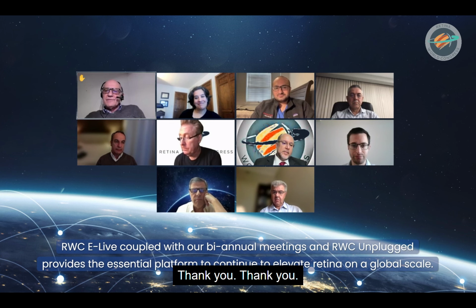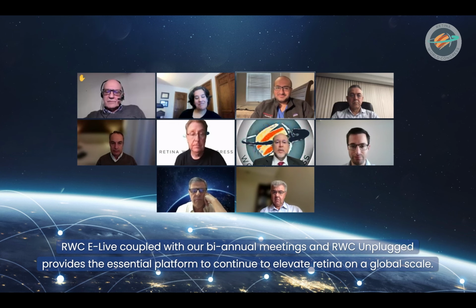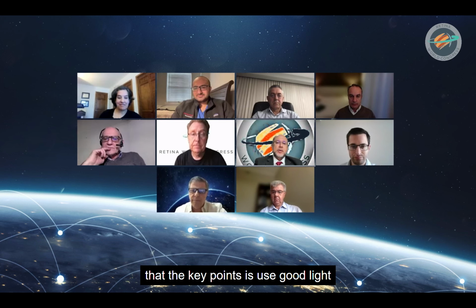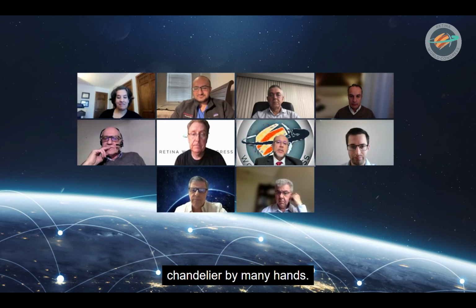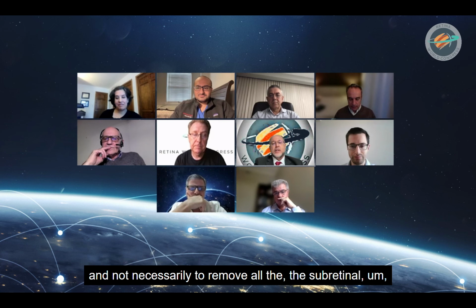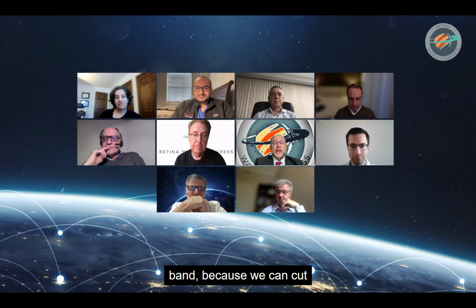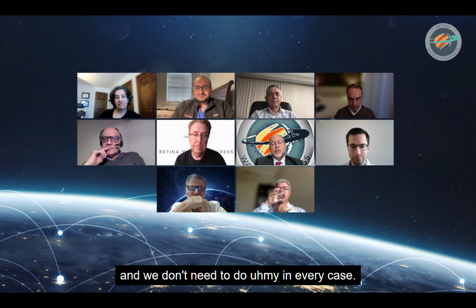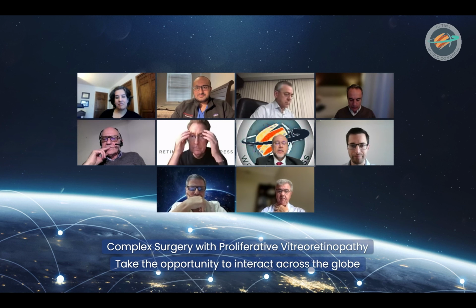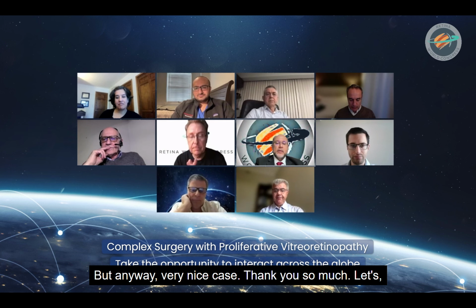Thank you. Very good. I think the key points are: use good light, chandelier, bimanual hands, take care to not enlarge your retinotomy, and it's not necessary to remove all the subretinal bands, because you can cut, and you don't need to do retinotomy in every case. But anyway, very nice case.